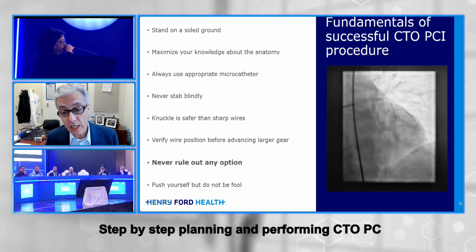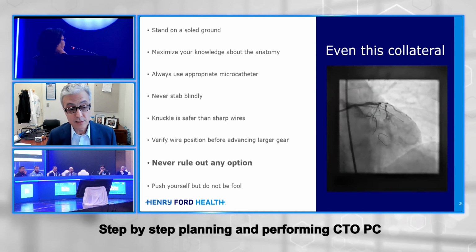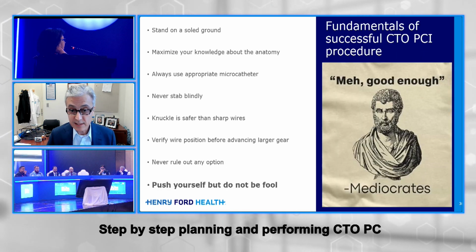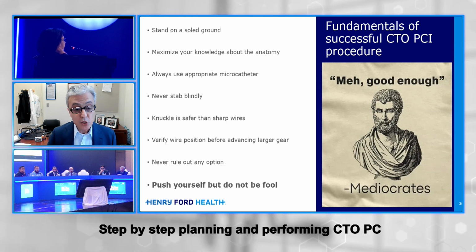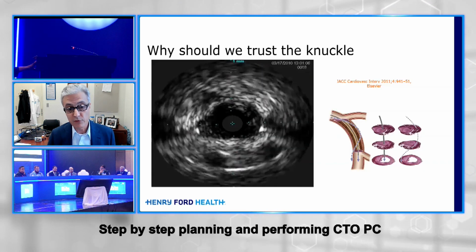Never rule out any option. Here, we were able to cross this collateral. This is like mediocrity, meh, good enough. That should not be your mode. Push yourself, but do not be fools. You should always strive to learn.